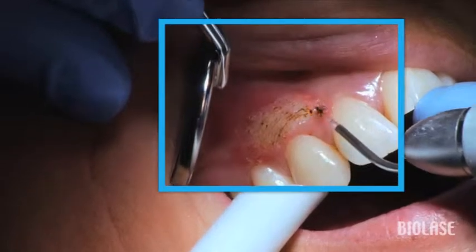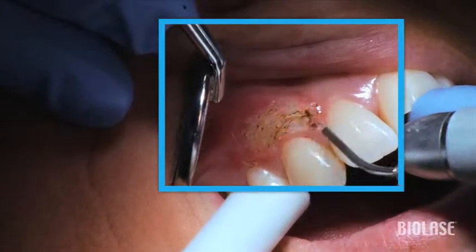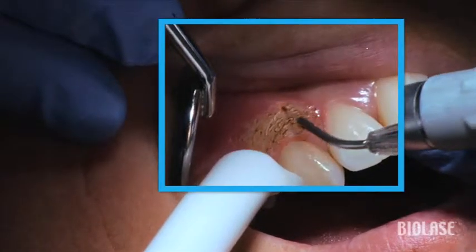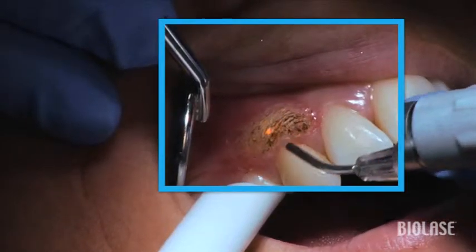As you do more of these procedures, you will learn what settings work best in your hands, how to evaluate each patient's tissue type and thickness, and how both speed and position of the laser tip in relation to the tissue all have an effect on laser performance.